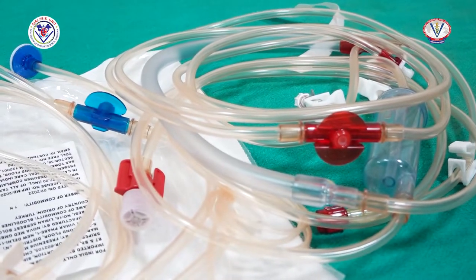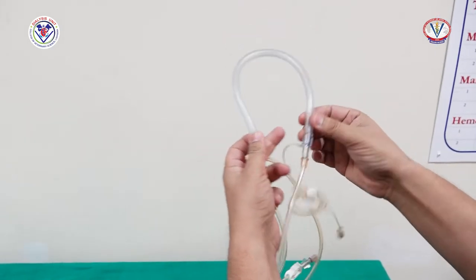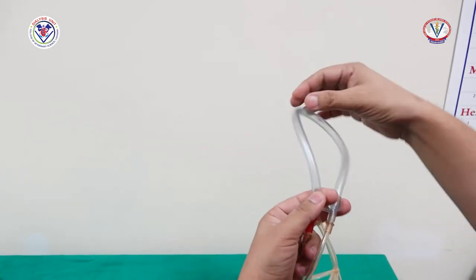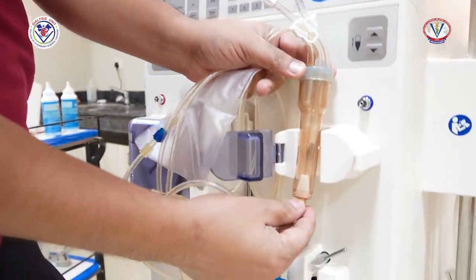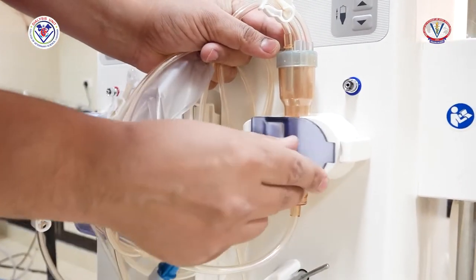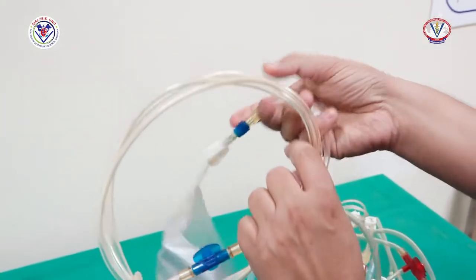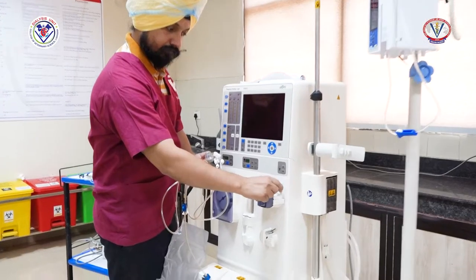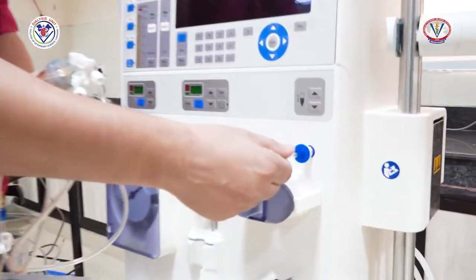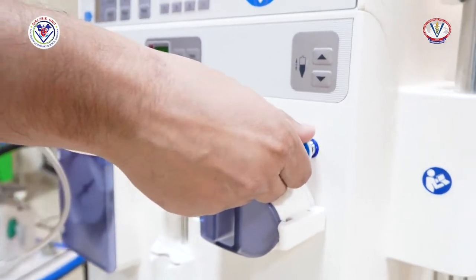In this arterial line, there is a portion with a large diameter, which is basically the blood pump part of the tubing. Likewise, in the venous line, there is a venous chamber, which fits the venous part of the dialysis machine. Always make sure to lock the clamps of blood tubing after opening the package. Also, there are arterial and venous pressure monitoring ports in both the arterial and the venous line.